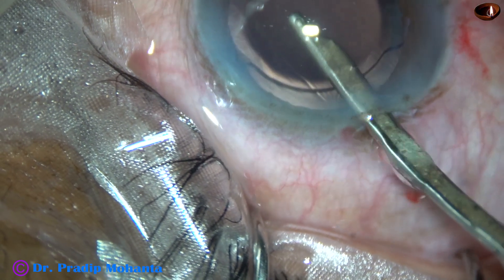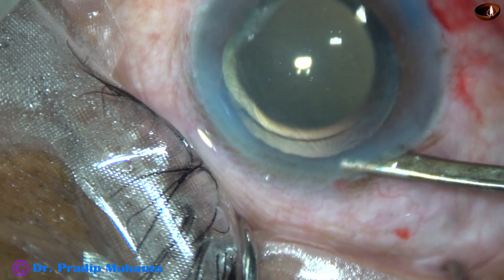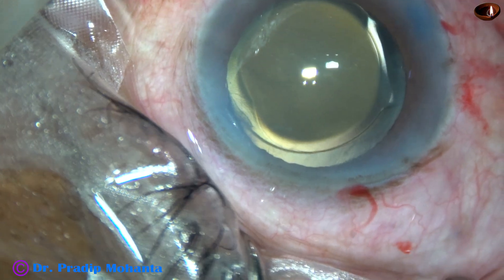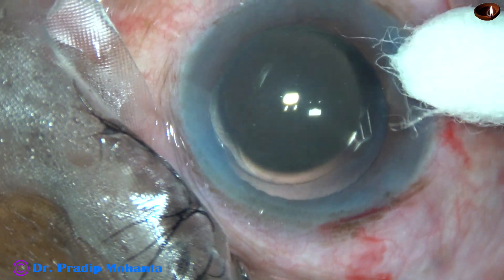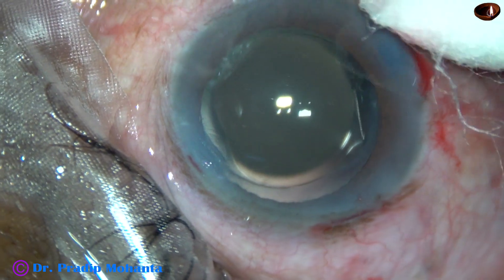At this time the eye got out of focus — sorry for that. The anterior chamber is nicely formed. The IOP is kept on the higher side of normal. The integrity of the wounds are checked. This is a totally unedited recording and you have not missed anything. So here we conclude the surgery.